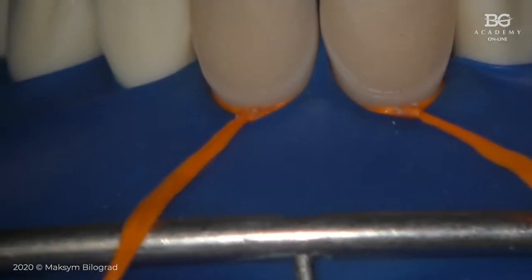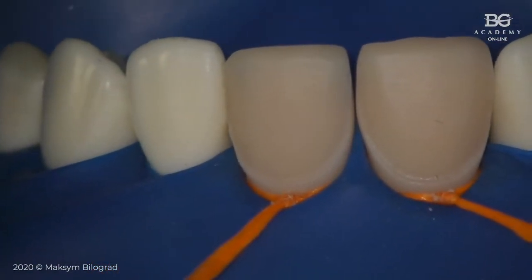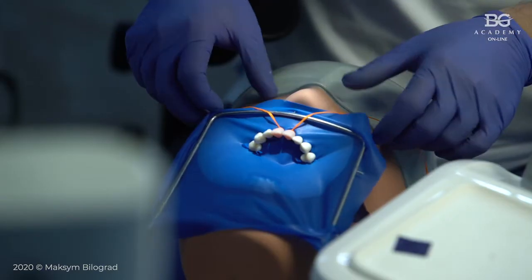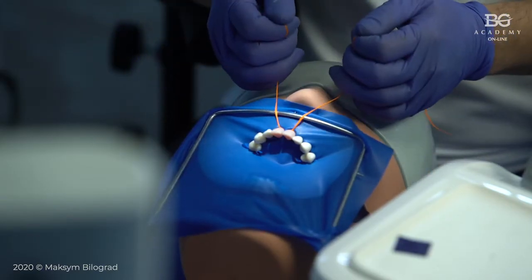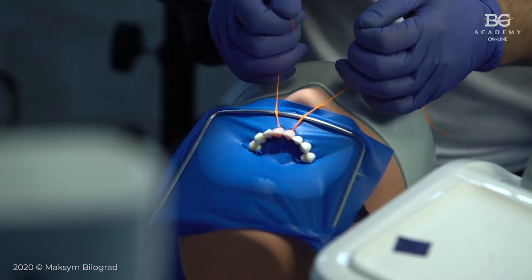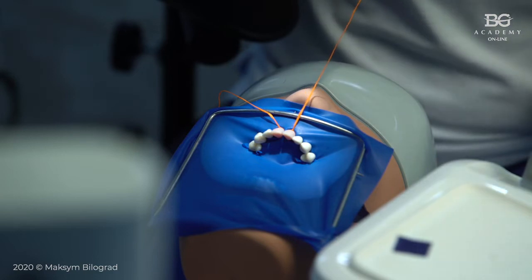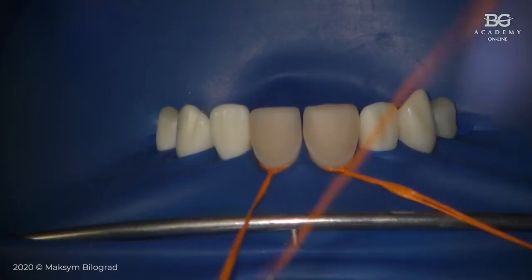have our rubber dam placed, we have inversion, now we have exposed finish lines. Okay, if you would like to get more exposure of the finish line, like this for example, in this case you may use your frame. Now it's time to work with this frame that is upside down.